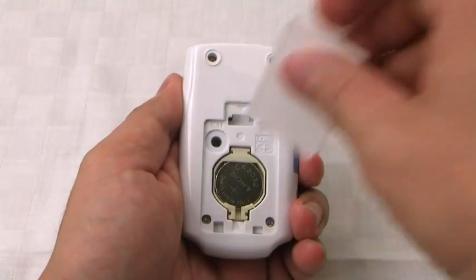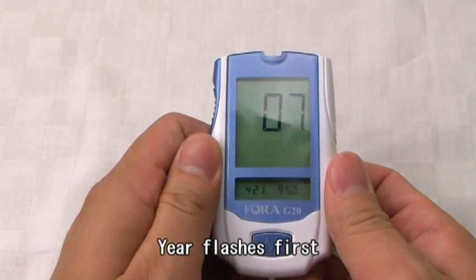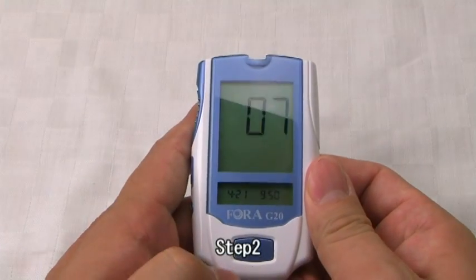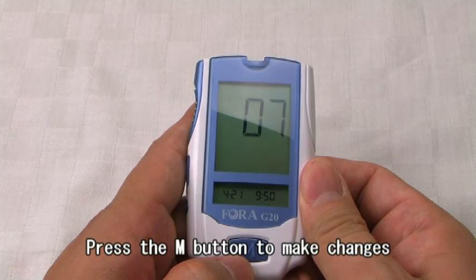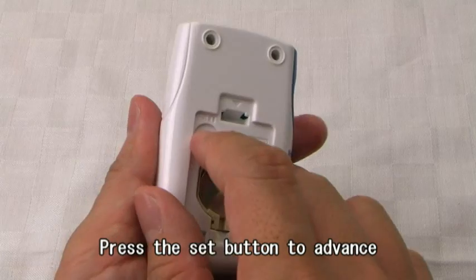Set the Meter. Step 1: Press the Set button to start setting. The year flashes first. Step 2: Press the M button to make changes. Press the Set button to advance.